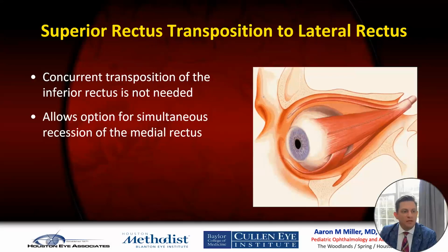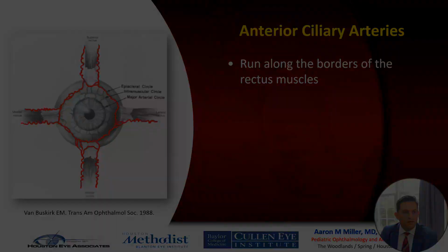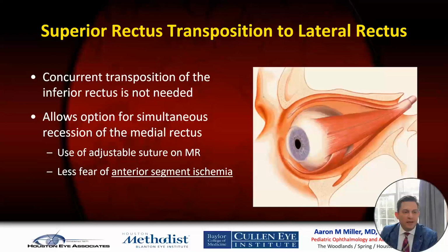The benefit of this is that it allows for concurrent surgery, as transposition of the inferior rectus is not needed. And it allows for simultaneous recession of the medial rectus muscle.